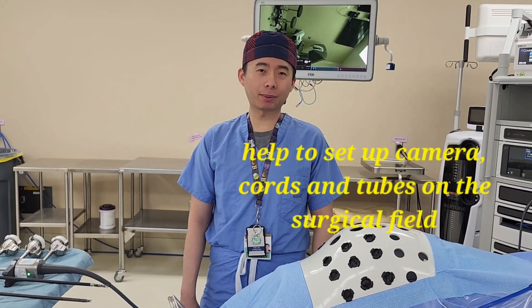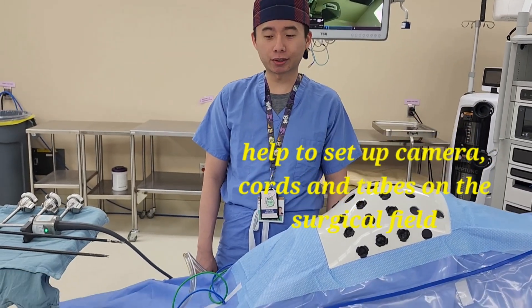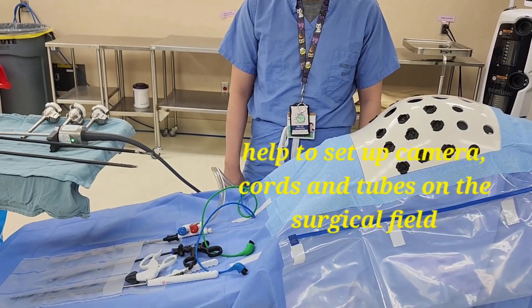Bedside, after the patient has been draped and before the robot has been docked, it is our job to assist with setting up all the cords: the bipolar, the monopolar, the suction, and the camera.